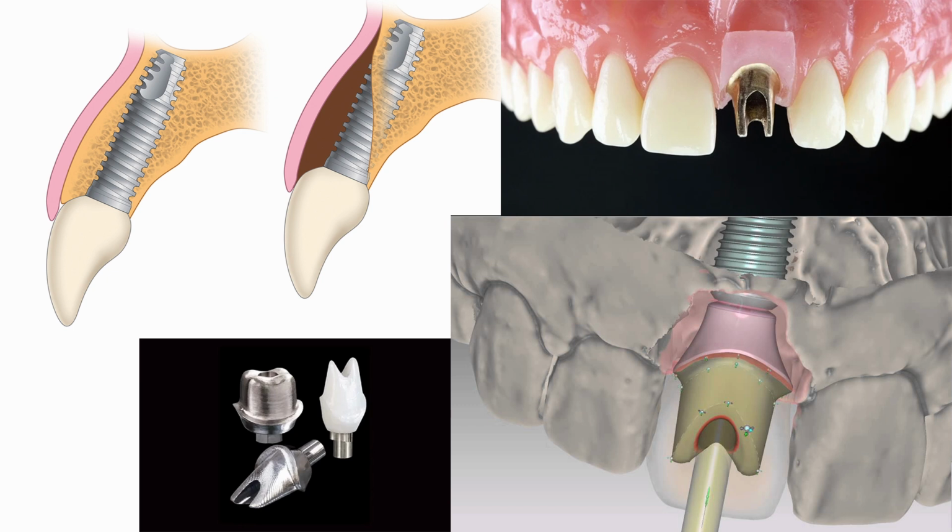When using cement-retained implant prostheses, there is always concern about abutment screw loosening. To reiterate, without an implant system that has a locking taper abutment connection, cement-retained implant prostheses are simply not feasible. When using a Morse taper screw-retained implant system, screw loosening tends to begin after approximately 5 years. In my experience, the stability of Morse taper screw-retained systems is about 5 years. After around 5 years, abutment screws tend to start loosening. Of course, in some cases, screw loosening occurs even earlier.